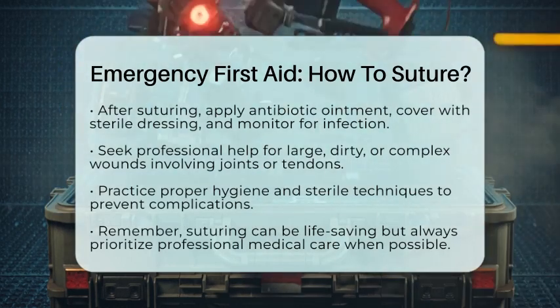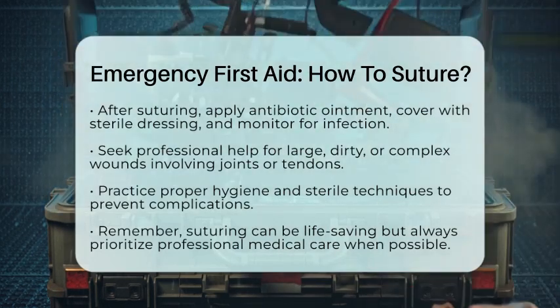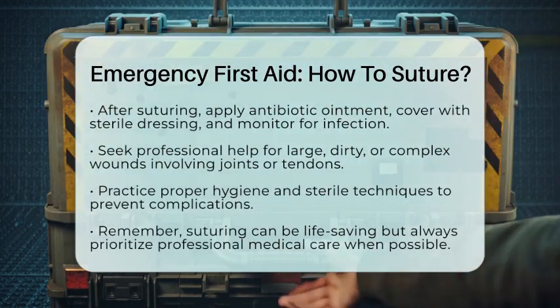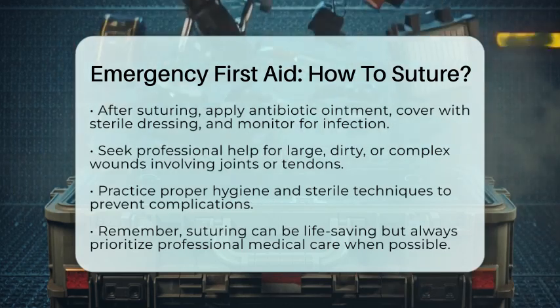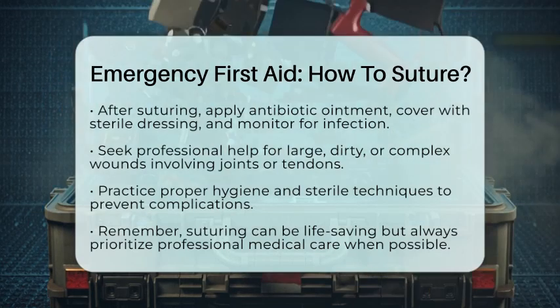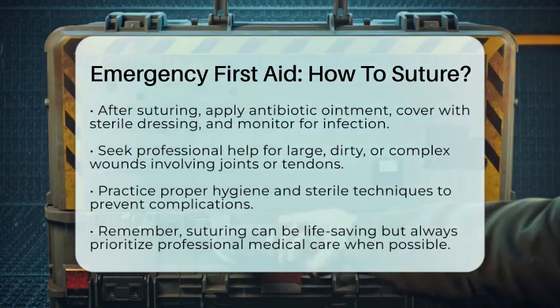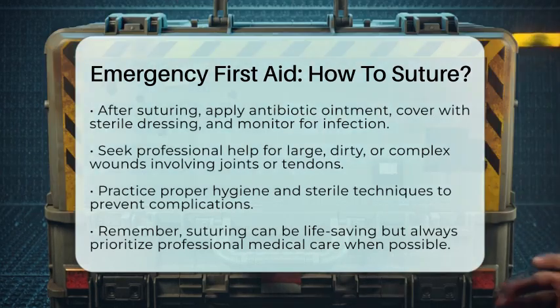After suturing, apply antibiotic ointment to help prevent infection. Cover the wound with a sterile dressing and change it regularly, especially if it starts to drain. Keep an eye out for signs of infection like redness, swelling, or pus. If the wound is large, dirty, or involves joints or tendons, seek professional medical help as soon as possible.